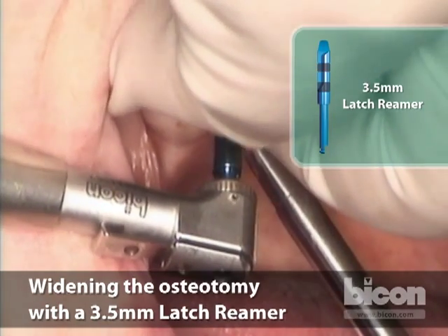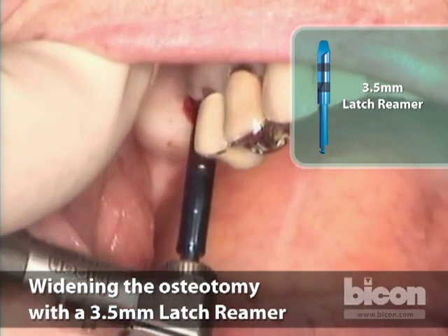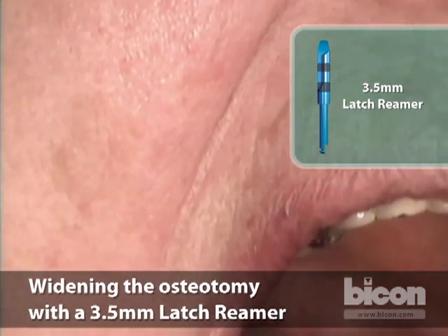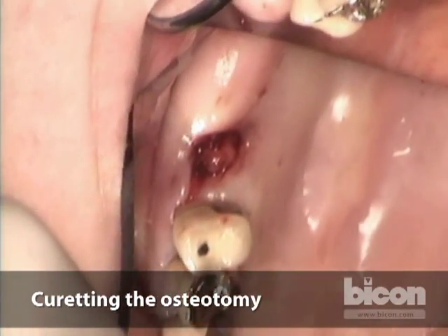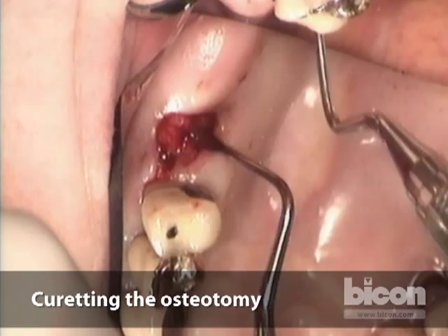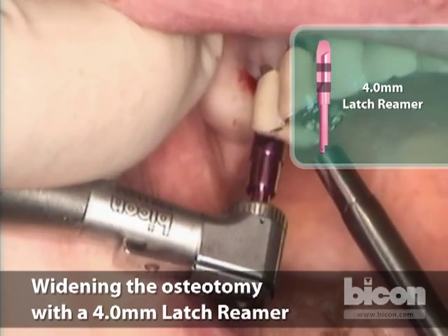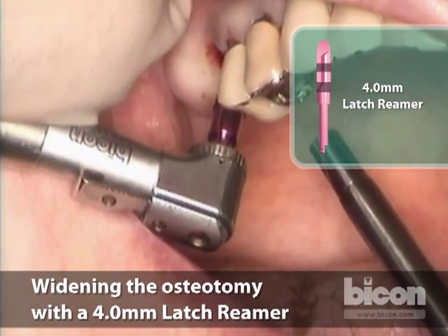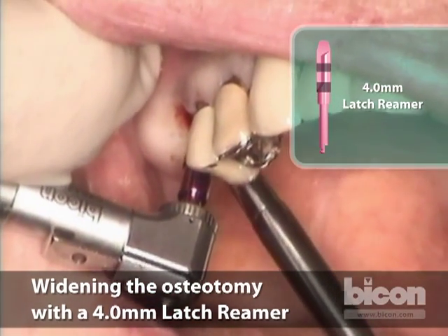You can also palpate the palatal — that's another advantage of slow reaming: by palpating you get a significant warning of about a millimeter before you fenestrate or perforate. You can see there are some bone shavings, or maybe remnants of the osteoid or scar forming in the socket; we'll remove that and continue. It still has a tendency to want to slip into one of the sockets rather than the osteotomy, so always pay attention. Once we reach 4 to 4.5 mm this will be a lot less likely.